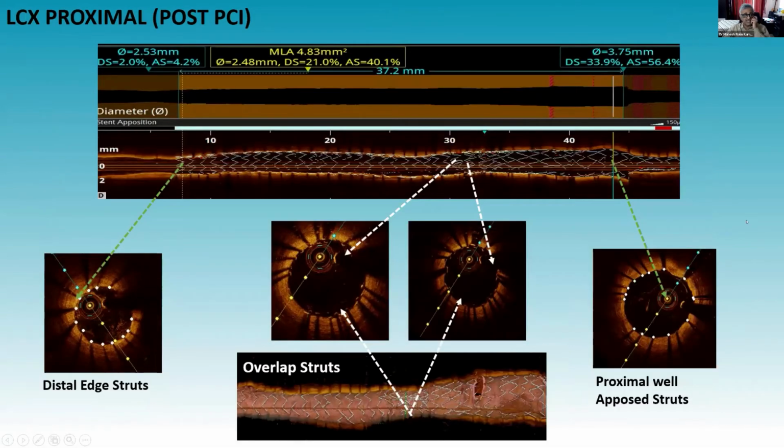This is the post-stenting. This is a circumflex stent. You can see one stent in the circumflex, overlap, second stent in the circumflex. This is the DK crush stent. Can you see the 4 struts which are outside, into the LAD left main? Those are the struts where you have to enter carefully.